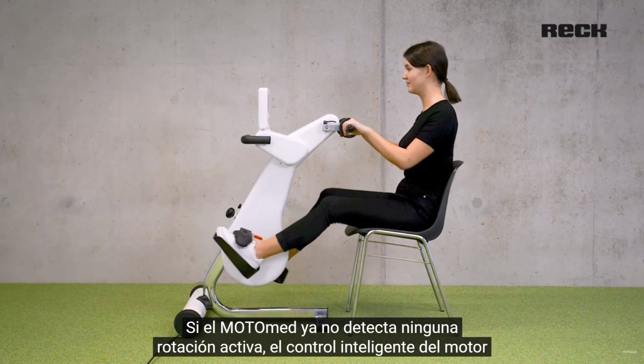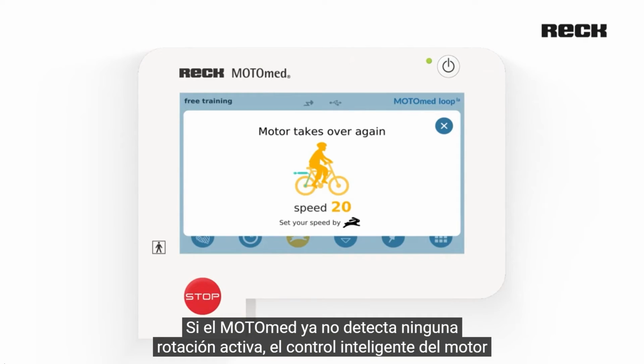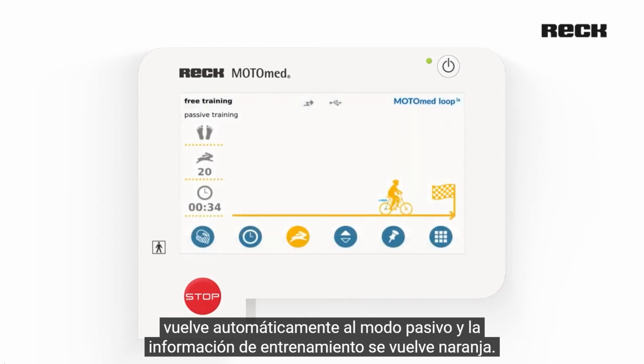If the MOTOmed no longer detects any active rotation, the intelligent motor control automatically switches back to passive mode, and the training feedback turns orange.